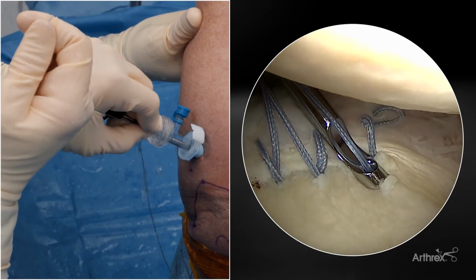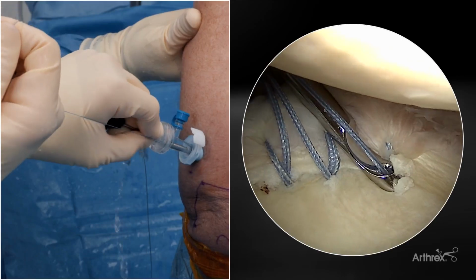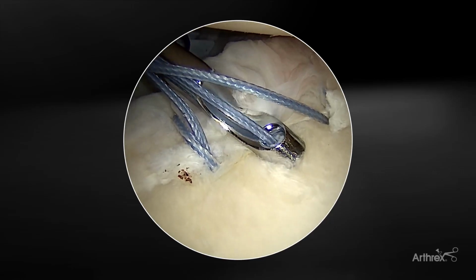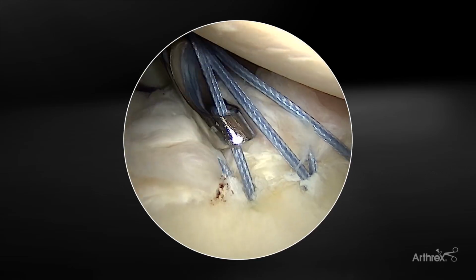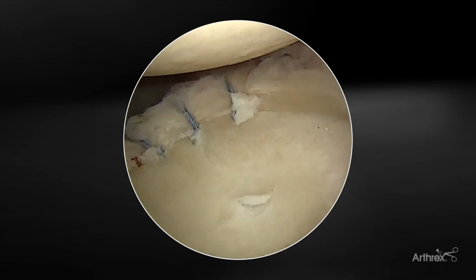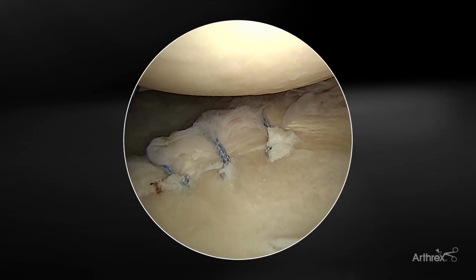And as I'm holding it here, now I'm going to take the tension of this anchor and start to shift this in place. One of the nice things, again, about doing this is we can just cut all these at the end. So if there's anything that you want to get more tension, we still have the ability. Then we're able to just go in and cut our sutures. You can see we've restored the labrum. We've got all our sutures under great tension. We've restored that nice roll, that labral roll at the posterior inferior aspect.